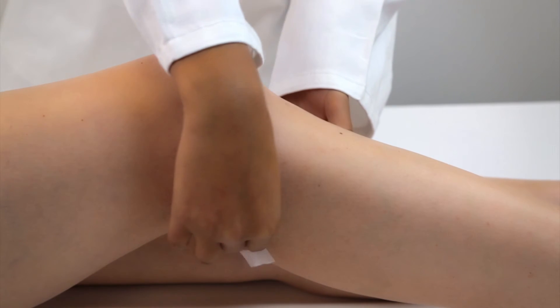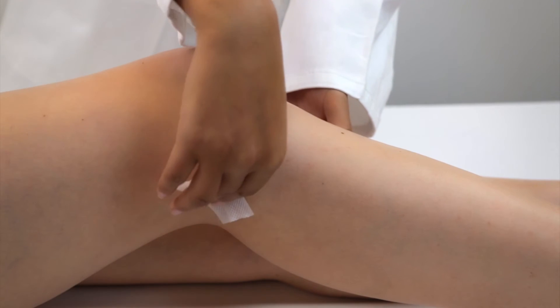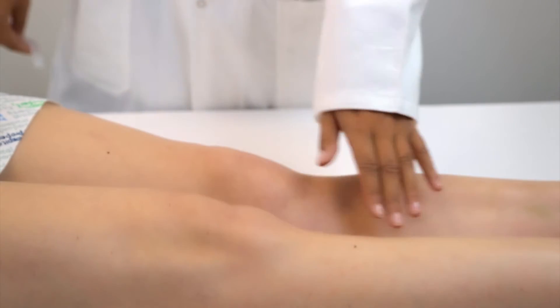For best results, remove any moisturiser if present. This can be removed effectively with soap and water prior to the light exfoliation and alcohol wiping. Using trimmers and clippers, remove any excess hair. Avoid wet shaving, as this can damage the skin and increase the risk of irritation.